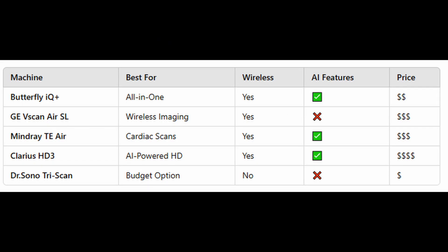Here's a quick comparison of these ultrasound machines, focusing on image quality, portability, battery life, and price. The Butterfly IQ+ is your all-in-one pick — it's wireless, includes AI, and is a medium-priced option. The GE VScan Air SL excels in wireless imaging — it's wireless, lacks AI, and is a more expensive choice. The Mindray TE Air is your go-to for cardiac scans — it's wireless, includes AI, and is also in the more expensive price bracket. The Clarius HD3 stands out for AI-powered HD imaging — it's wireless, includes AI, and is the priciest option. Finally, the Dr. Sono TriScan is the budget-friendly option — it's not wireless, doesn't have AI, and is the most affordable at a low price.